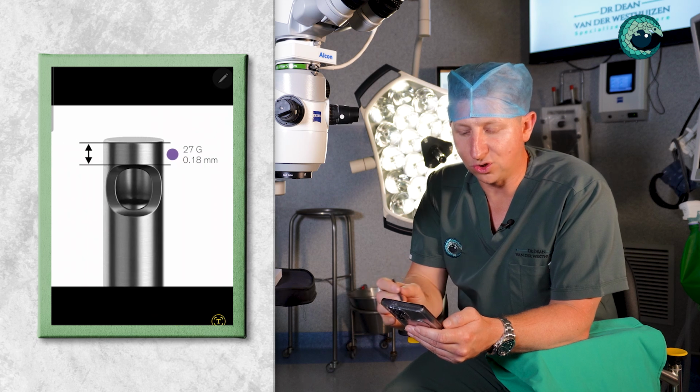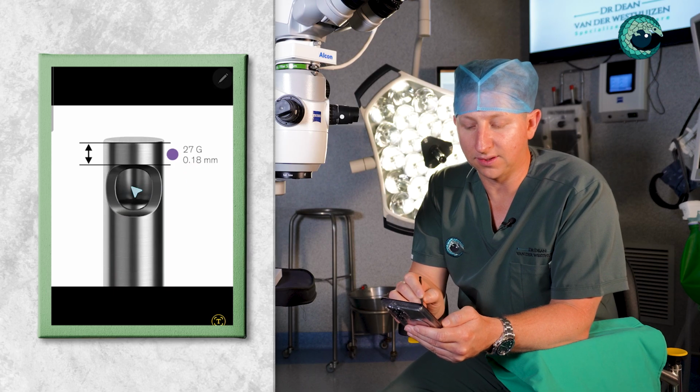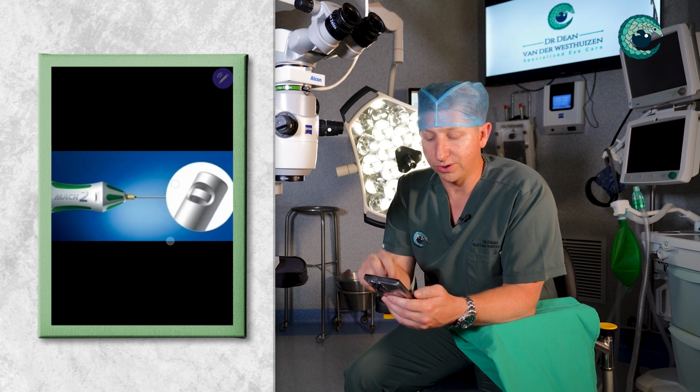If you look at this instrument, this is the end of it. This is the hole on the side of the cutter where vitreous can come in as it sucks, and inside here is a blade that cuts. This little blade moves backwards and forwards inside this chamber. So as vitreous gets pulled in here, it cuts it and prevents pulling or causing traction on the retina.